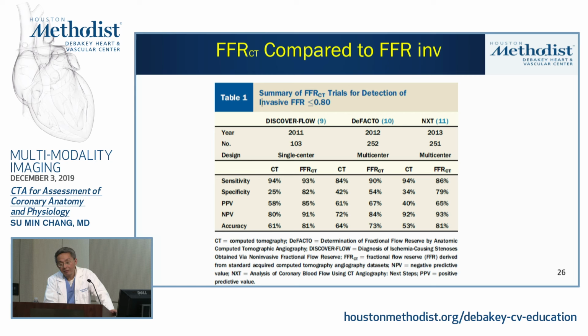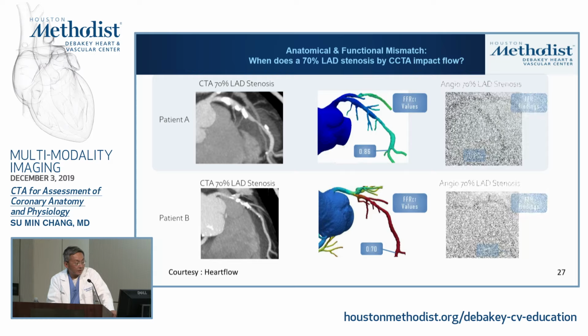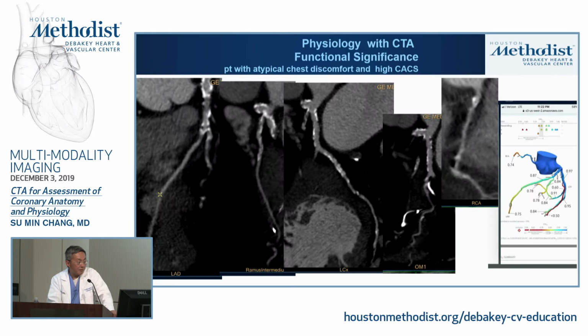85%. If you compare to PET, MR perfusion, the number is about in the same ballpark, okay? So I want you to make sure you get out of here knowing that CT-FFR, or FFR derived by CT, is not the same as invasive FFR, okay? Okay, so these are some examples.